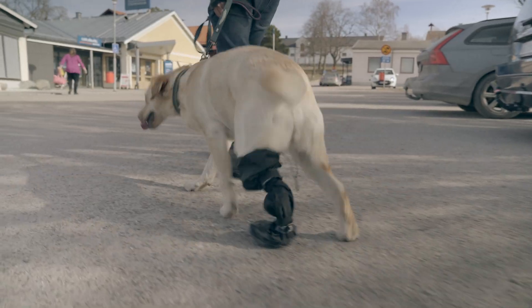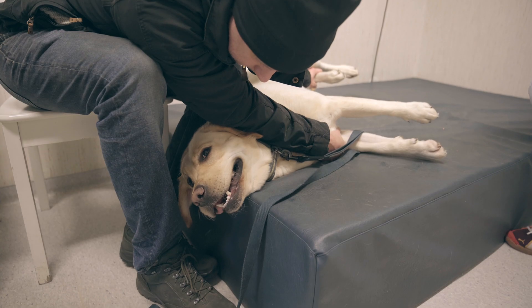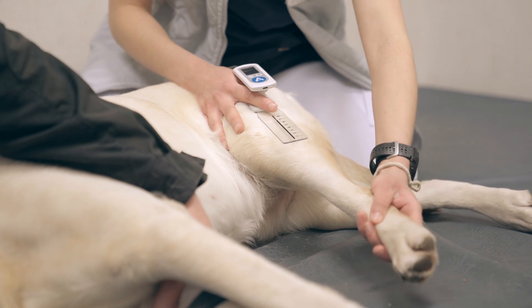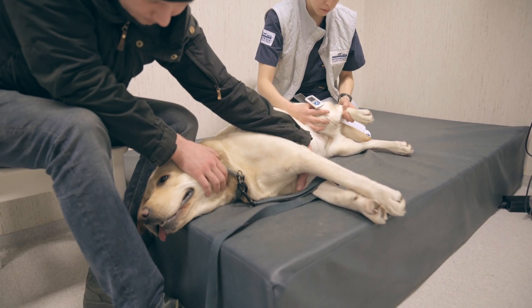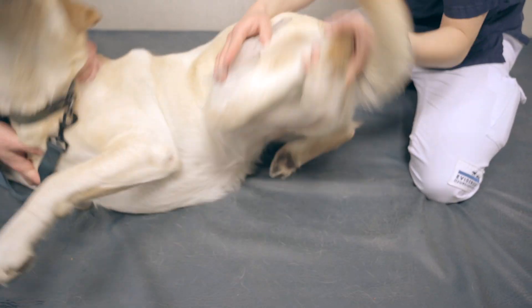Visits to the veterinarian are often stressful, as the injured pet can be in pain, bringing a lot of worry to the pet owner. Time is limited, so finding ways to efficiently make an assessment while keeping the pet calm and comfortable is crucial. Traditional measurement tools are hard to read and they require both hands.